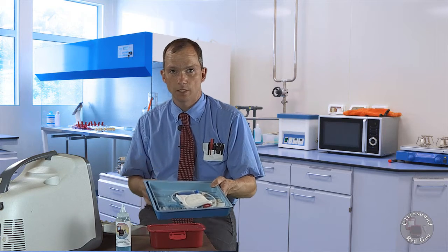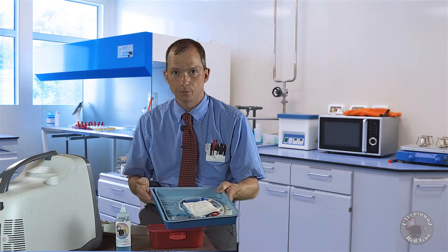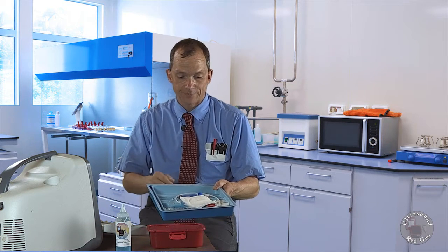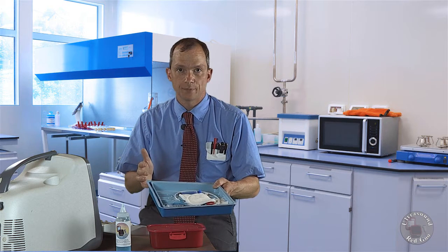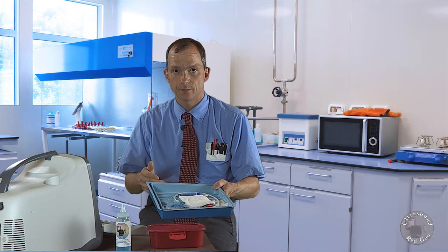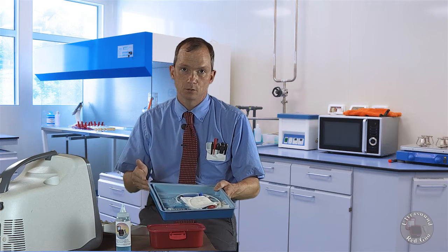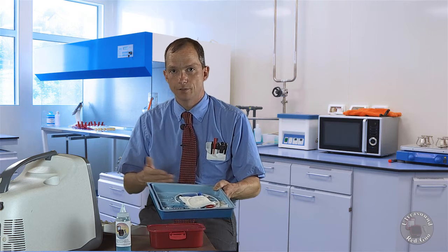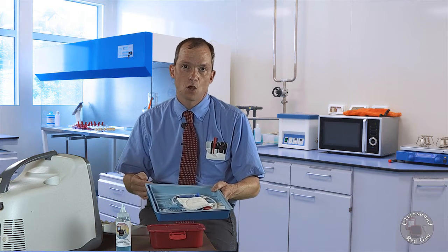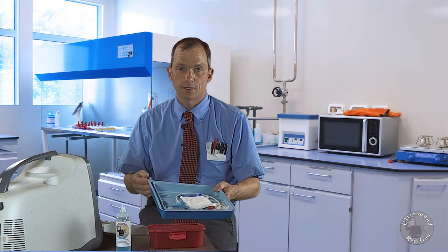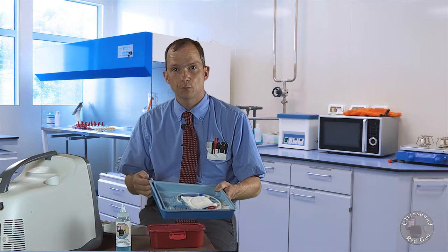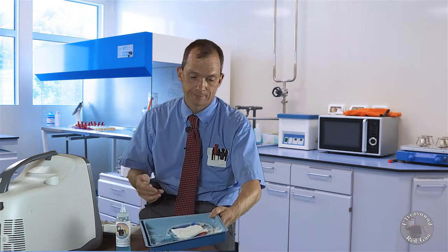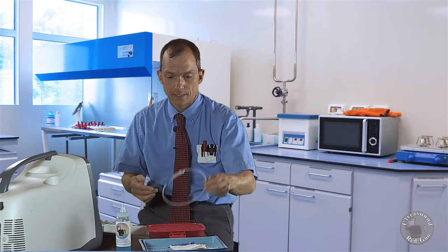Now you can use any kit you want - triple lumen catheter, double lumen catheter. In this case here I have a 20 gauge single lumen catheter which is very similar to what I would typically use for either a single lumen jugular access on a very petite or pediatric patient, or more frequently I'll use for a femoral arterial line or brachial arterial line.